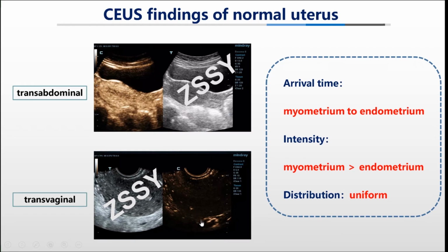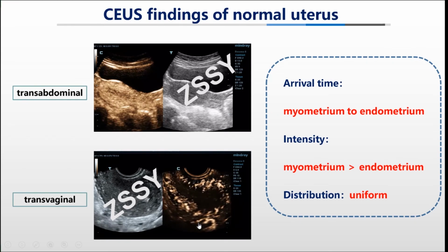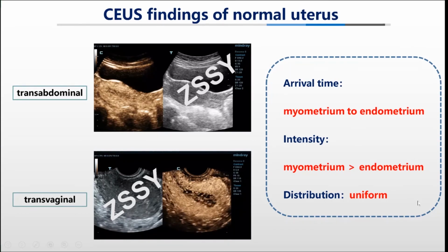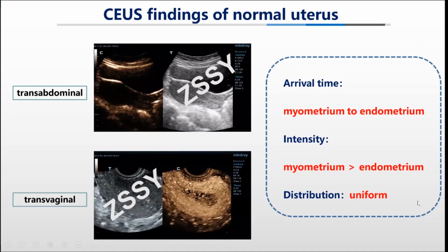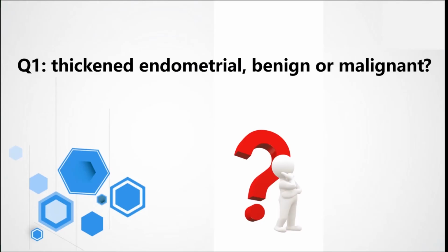Here is the transvaginal CEUS, showed the same process as transabdominal CEUS. And here is the features. Then, when we encounter complex cases where we need CEUS, I will show you some examples.